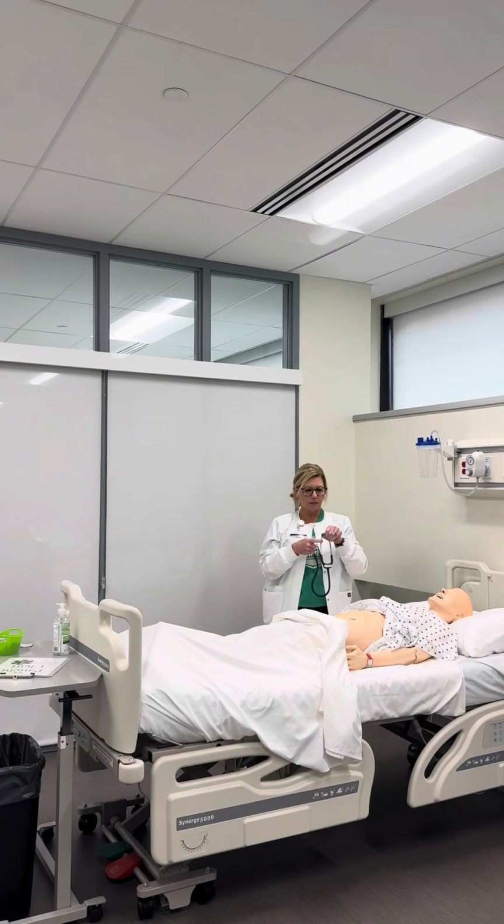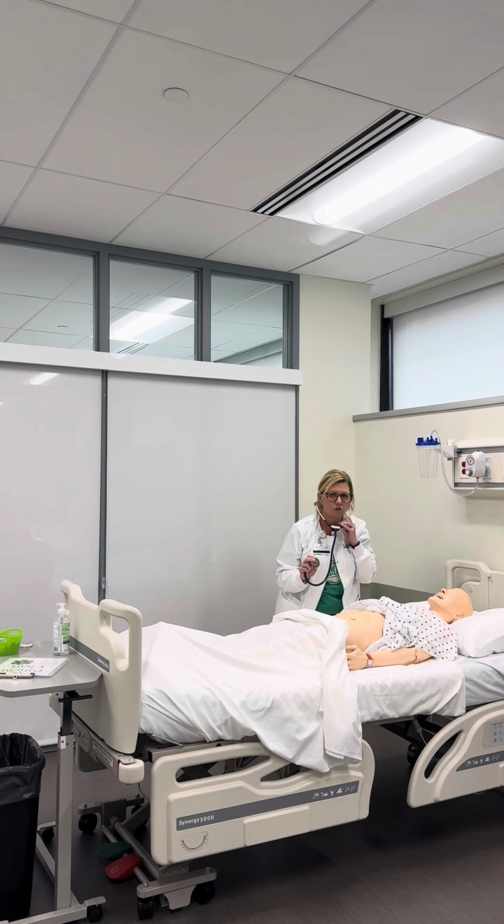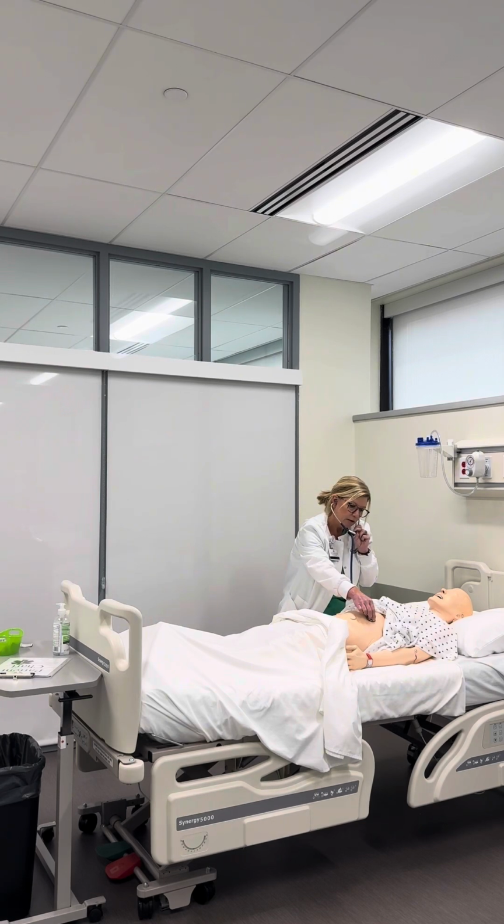So I already cleaned my stethoscope. I will listen in each quadrant for 1 to 2 minutes. And if I don't hear bowel sounds, I would listen for 5 minutes. So I want to start in the right lower quadrant and work around clockwise. So first I want to listen. I would listen for 1 to 2 minutes for bowel sounds. Then I'm going to go up to the right upper, and the left upper, and then the left lower quadrant.